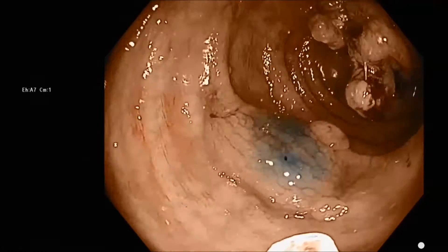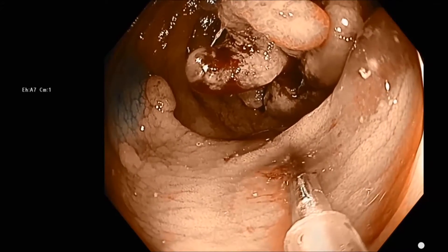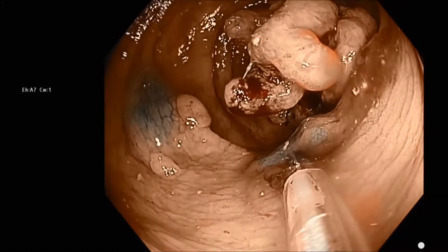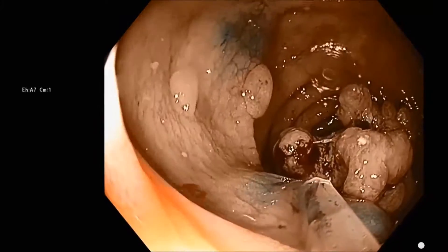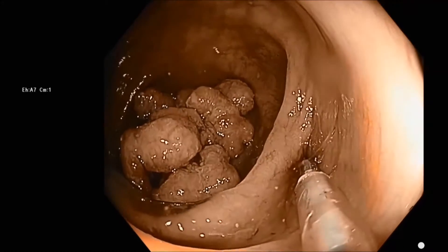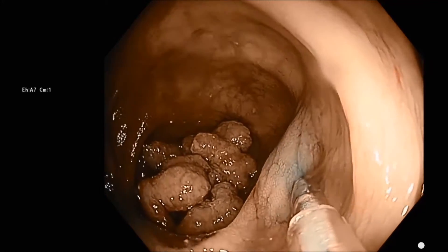We're going to mark distal to the tumor using the bleb technique. I'm making the blebs with the same submucosal injection fluid used for EMR on a lesion proximal to this in the colon. We've already been to the cecum, removed that lesion by EMR, and we have some extra fluid left over with indigo carmine in it.